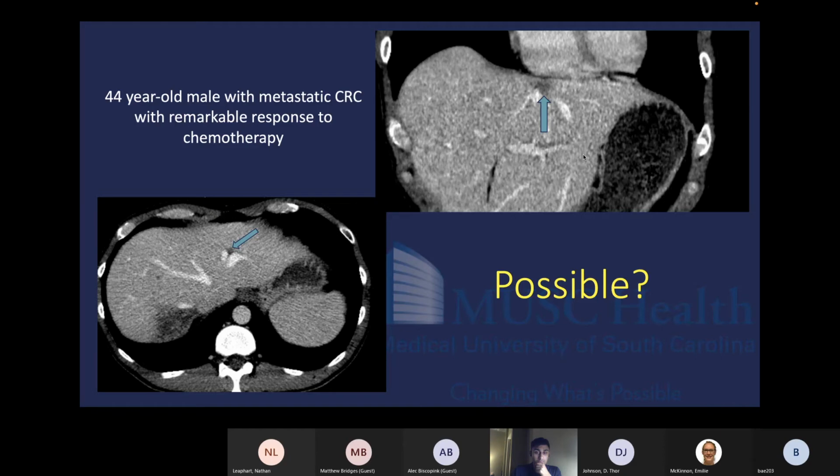You can see it sitting right on top of the hepatic veins. The two bright things behind the dark spot, that tumor is the dark spot, are the segment 4 and the segment 2-3 branches of the left hepatic vein. So you really don't want to burn those, because if you cook those, that's a big problem, because then he can't drain that side of his liver anymore. And you can also see that it's 5 millimeters from the base of the heart. So that seems like a problem too in terms of not causing any trouble.